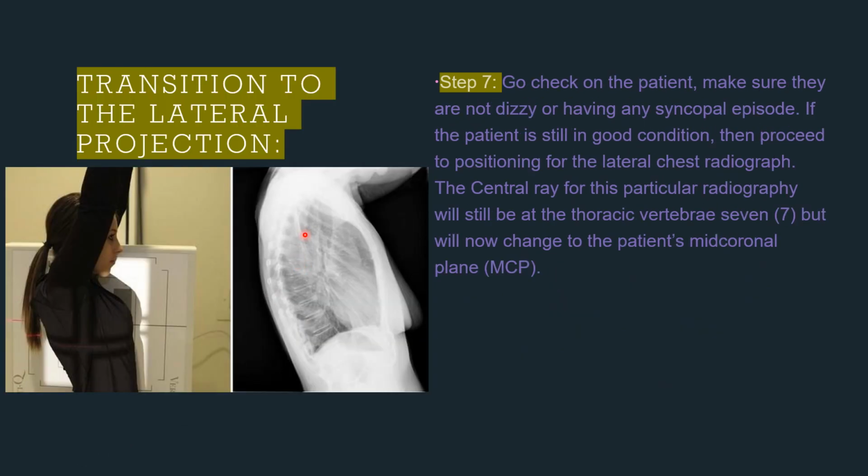Then you want to be able to, for the next step, transition to step 7 here, which is to transition to the lateral projection. You obviously want to go check on the patient and make sure they're not dizzy or having any kind of syncopal episodes.